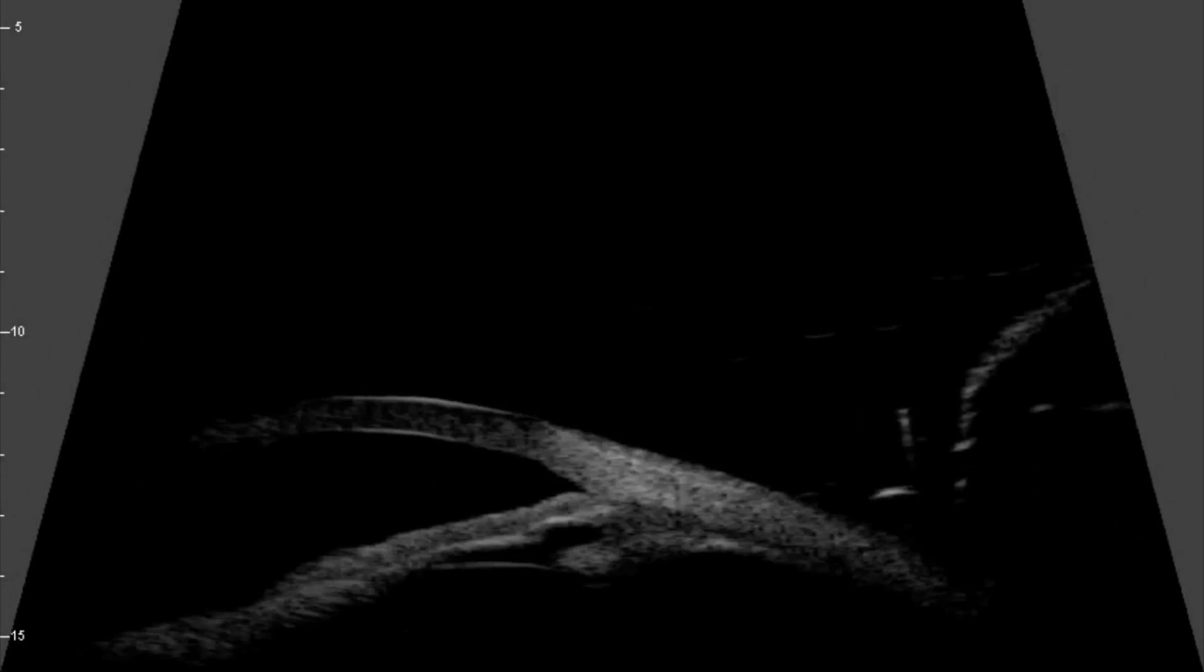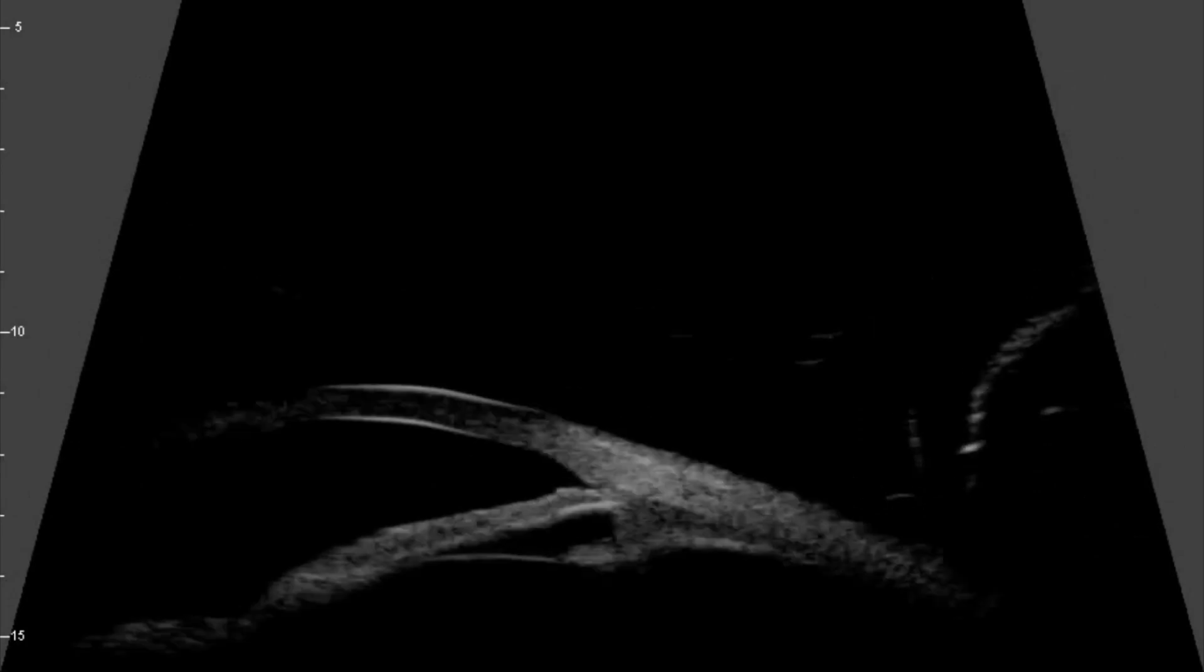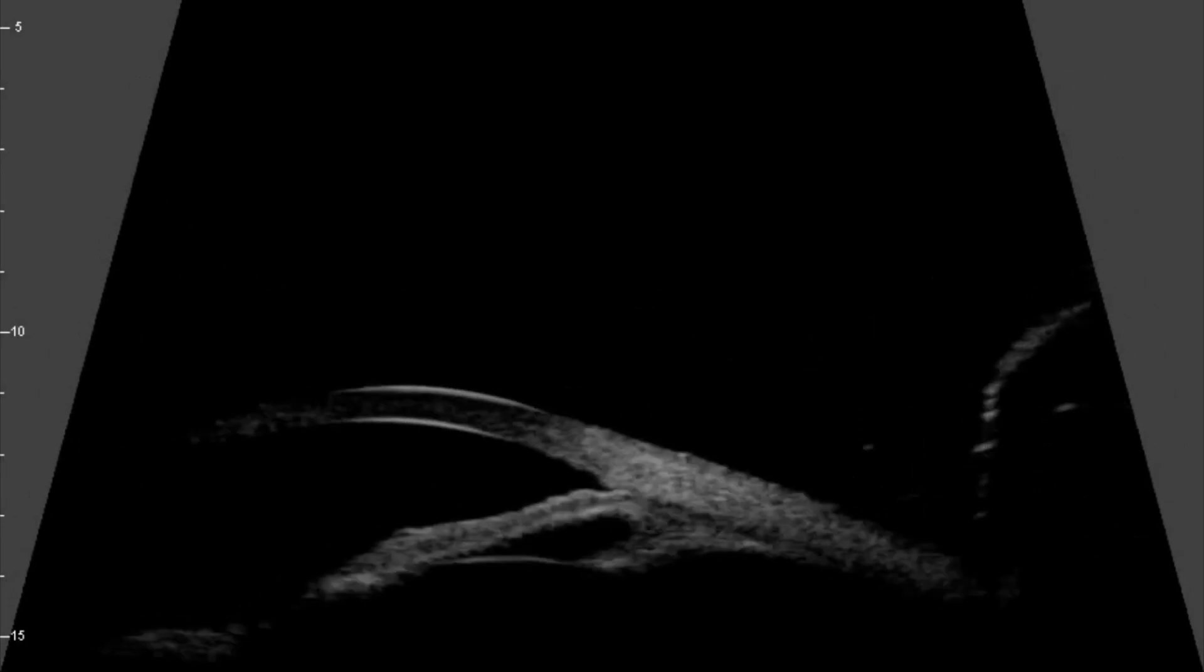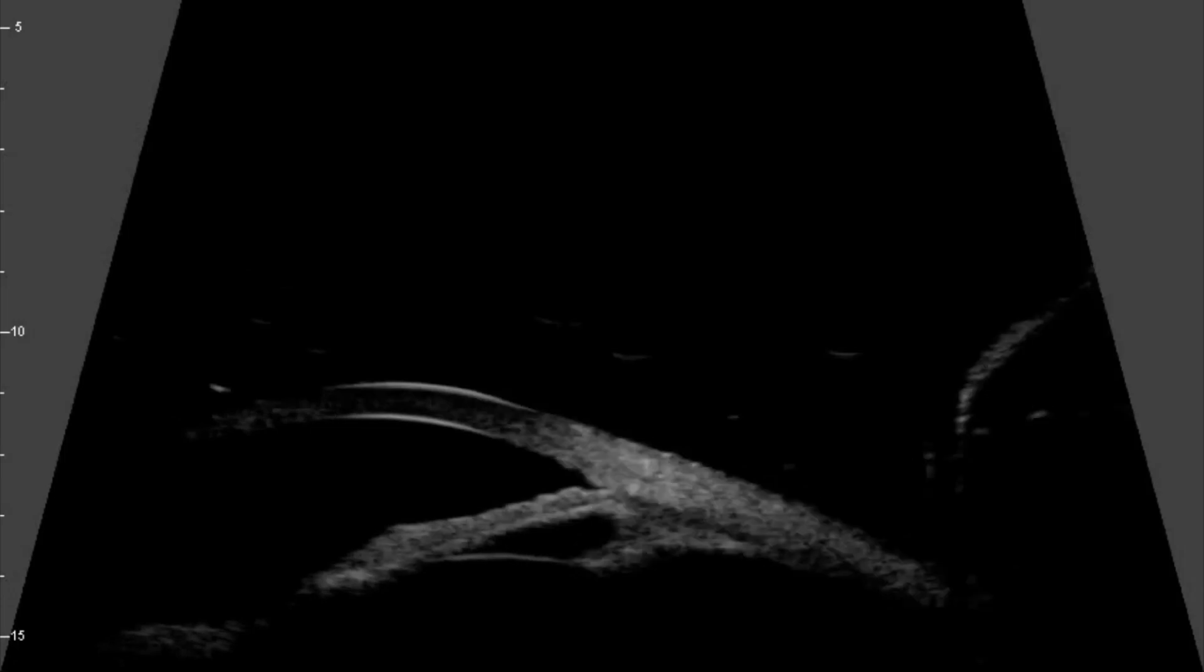UBM provides two-dimensional grayscale images of the various anterior segment structures and allows all these structures to be imaged simultaneously in their normal state as they occur in the living eye. The real-time image is displayed on the video monitor and can be recorded for qualitative and quantitative analysis.